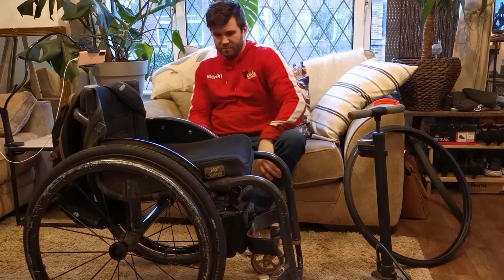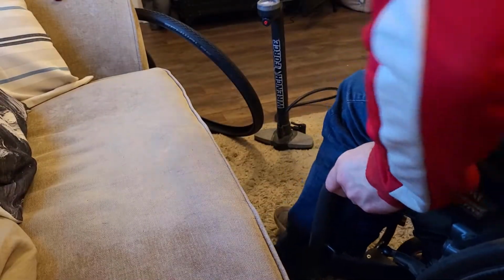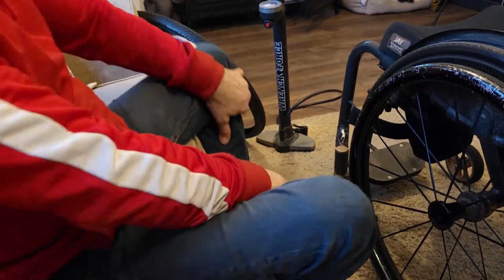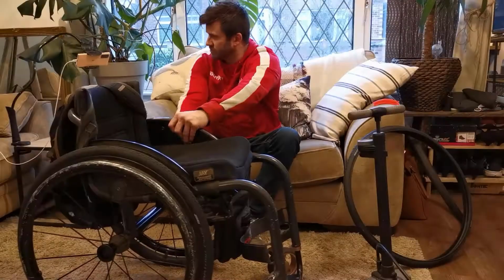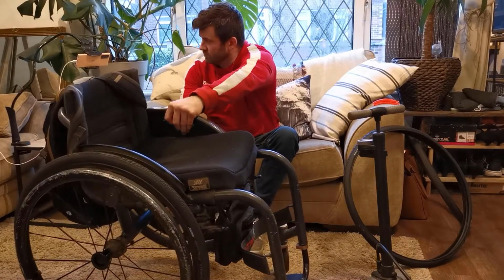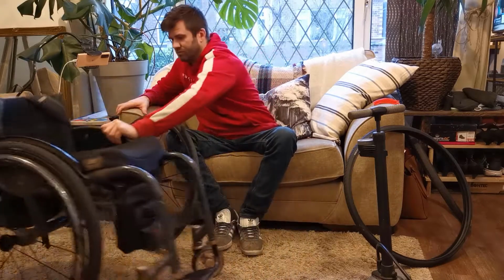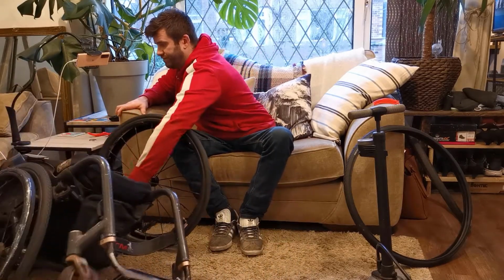inner tube. Now normally I would actually just change my wheels out and do it in my chair, but because the majority of people don't have spare wheels, I'm going to show you how I'd transfer onto the sofa here and change it from sat down there. Now I don't have any balance, being paralysed from the chest down, and I can't control my legs, so positioning my legs to give myself that extra balance is going to be quite important.